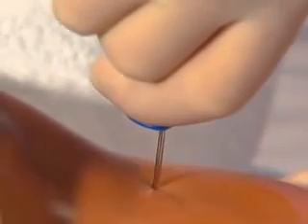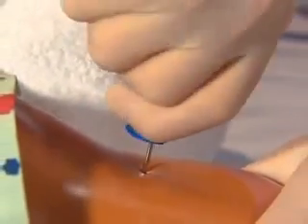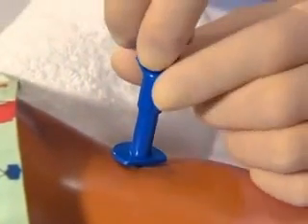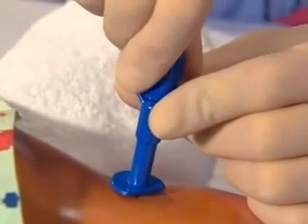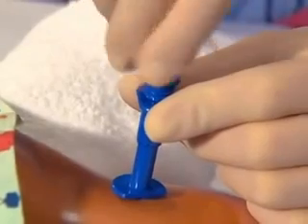Puncture the skin and continue through the soft tissue. Use firm, steady pressure and a rotating or coring motion to penetrate the bony cortex. You will note a sudden give with the loss of resistance as you enter the medullary cavity. Remove the needle cap and stylet.